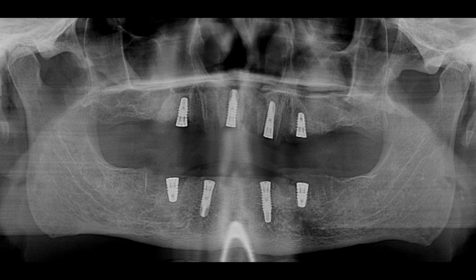Here's the panoramic image the day of surgery. You'll notice there's extra bone back here now for future implants. That has to heal for at least 6 months prior to putting the posterior or the back implants in. The sockets back here were too large for implants, and because we were delaying treatment on the upper arch, I decided to wait to put these implants in until later when we did the uppers.